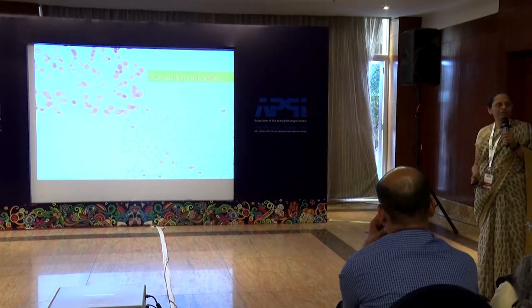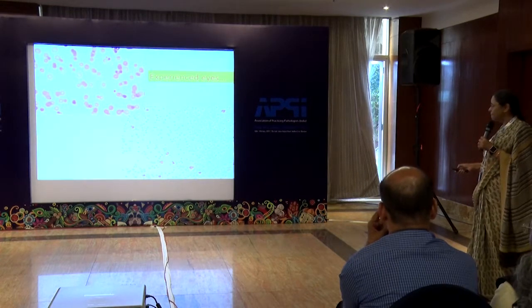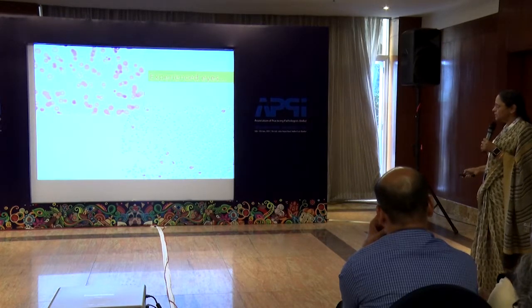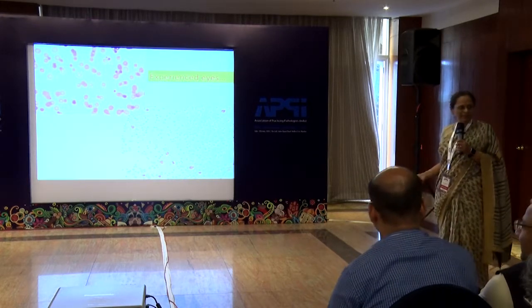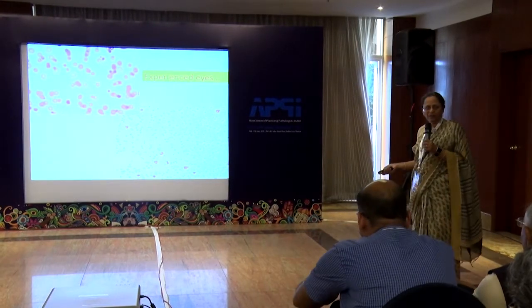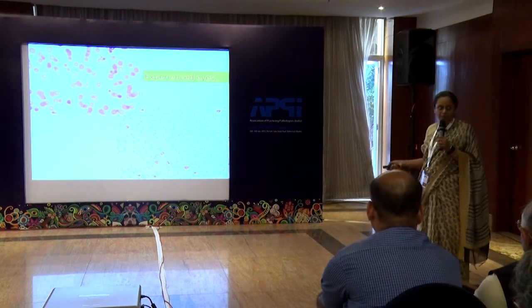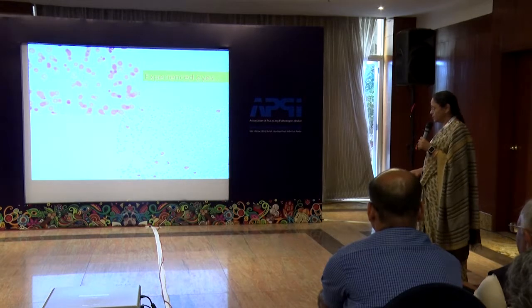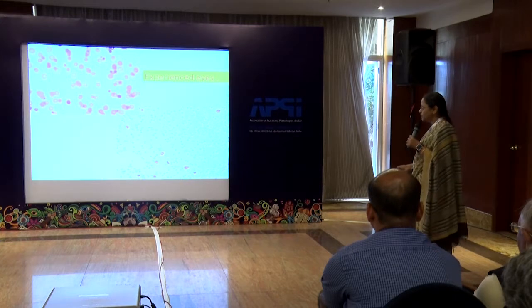I'm sorry I'm making you stand, but there is a very interesting diagnosis here if you can pick up. Each of these cells, it's a very classic picture. Do you think it's a poorly stained smear? Do you think it could be, maybe the smear didn't get air dried properly? But if I told you, that is not so. You heard Dr. Manchanda tell you how to make out a badly stained smear. You look at the other cells, they're looking quite good. So it's not a poorly stained smear. So these are not artifacts.